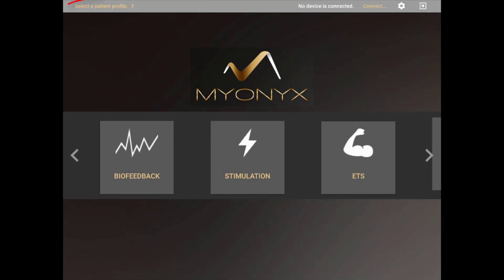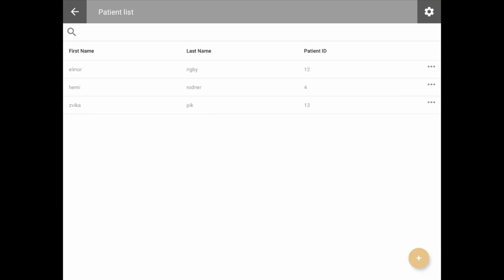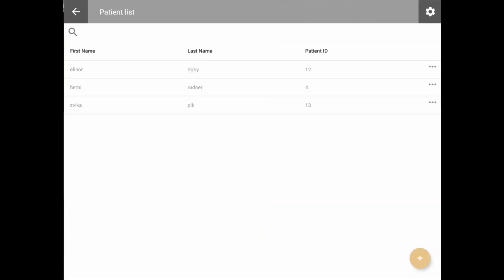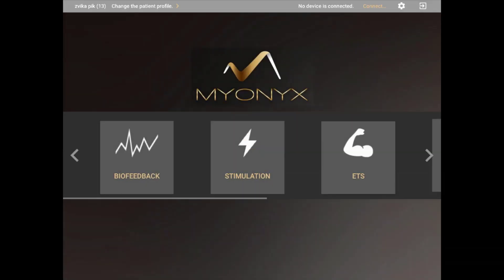You may then select a patient from the patient list by clicking Select Patient on the top status bar. Selecting and switching between patients can be done at any time from the status bar. You may also run a session anonymously with no patient selected. If a patient is selected, all the settings previously used with this patient will load automatically and the sessions may be saved into their patient file once completed.